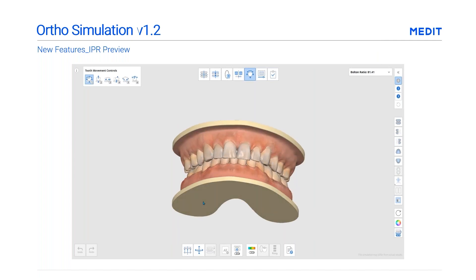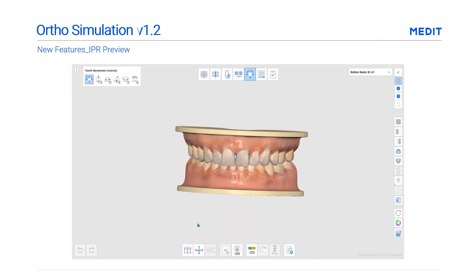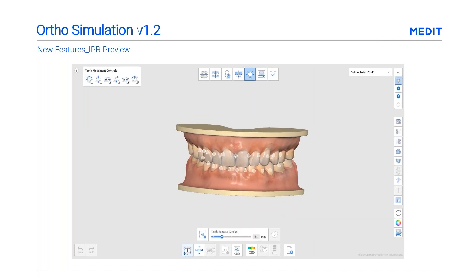On your screen you'll see that Medit has added an interproximal reduction simulation feature. You can easily preview the results with your patient. For those of you who are new to using Medit Ortho Simulation, we'll give you a quick description of what it actually does.